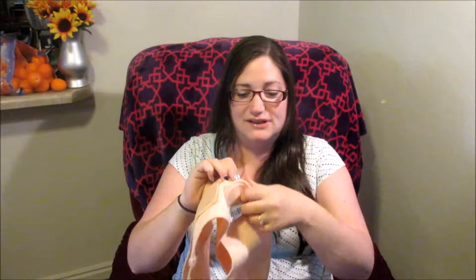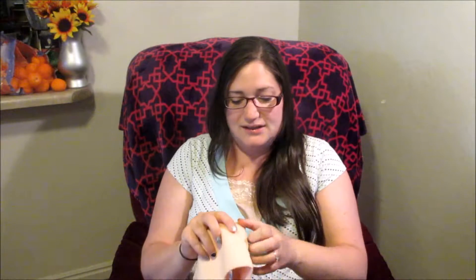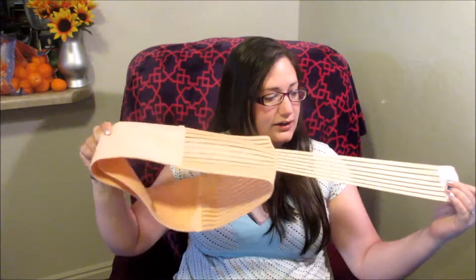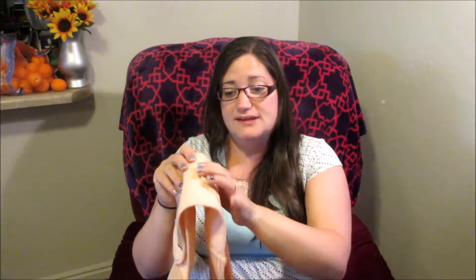I can't tell you anything about it other than that. Basically, it velcros like this — just velcros on itself. So you can adjust it pretty well. It's got these extra adjustment things; I guess it's supposed to stretch a little bit more. Maybe it should have fit me somehow and I didn't know how to do it, but they didn't have any instructions. Couldn't find anything on the website either.